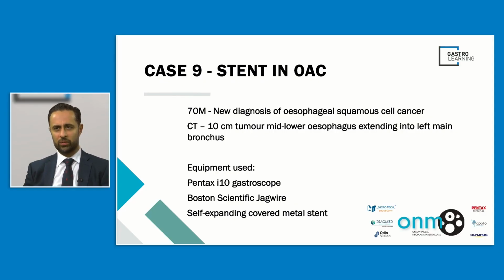So the case is a 70-year-old gentleman with a new diagnosis of esophageal SCC. On cross-sectional imaging, he was found to have a 10-centimeter tumour extending from the mid to lower esophagus, but unfortunately fistulating into the left main bronchus. So this is going to be a case demonstration both endoscopically but also from a respiratory aspect in bronchoscopy.